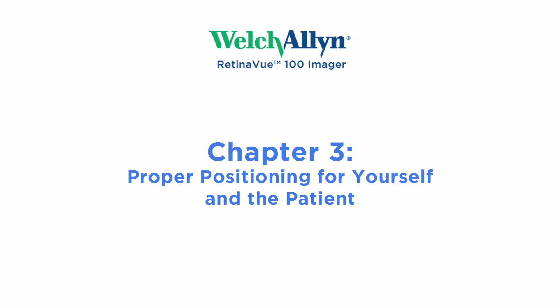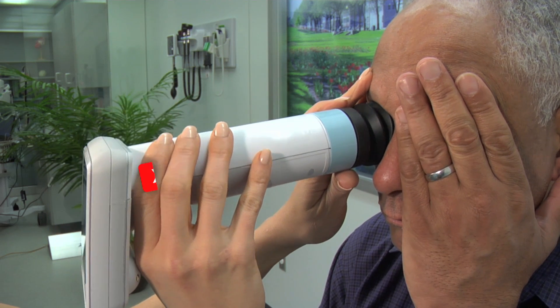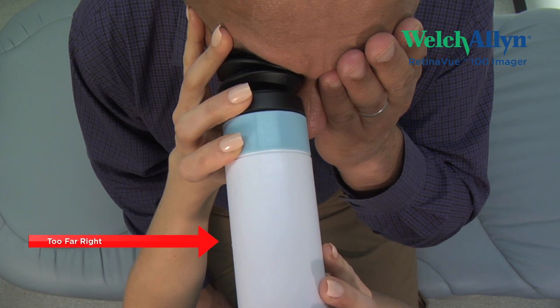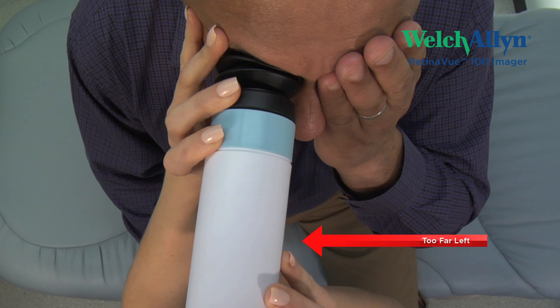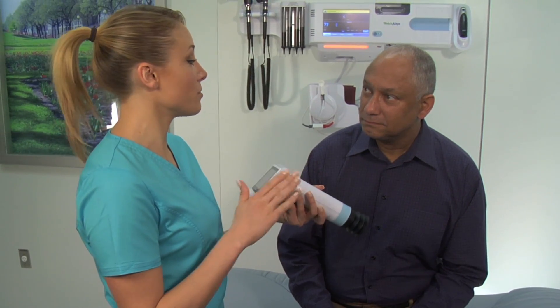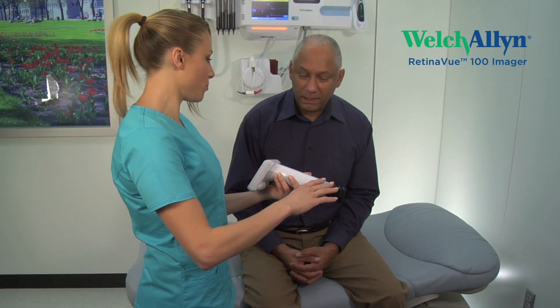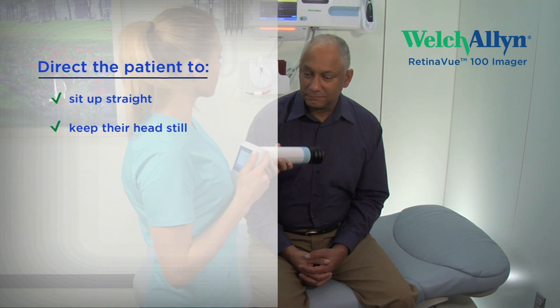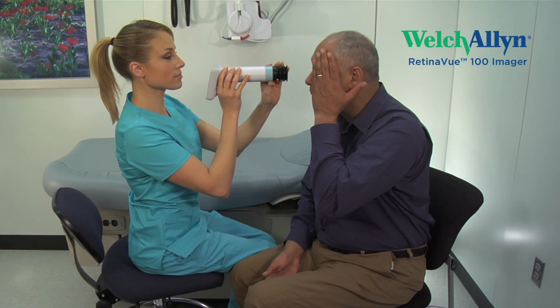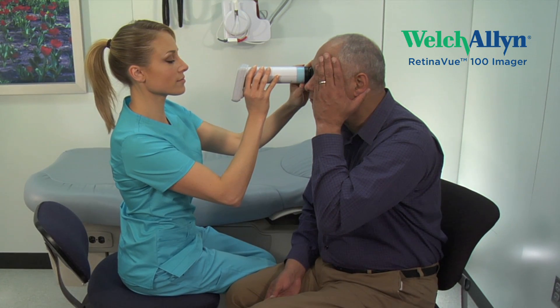Chapter 3: Proper Positioning for Yourself and the Patient. The RV100 must be held level and in line with your patient's eye. There are two recommended arrangements to properly position yourself and the patient for a fast and successful retinal scan. To use the RV100 with an exam table, have your patient sit at the table's edge, instructing them to sit up straight with their head looking forward and held stationary during the entire procedure — you will stand directly in front of them. You and your patient may also find it more comfortable to use the RV100 while seated, which may make it easier to position the RV100 properly; you should sit directly in front of them.